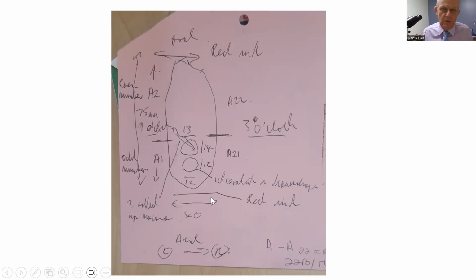Because Vikash also will have measured the size of his resection. Notice Vikash mentioned, for example, to pick up where 3 o'clock is, and I do the same. So I say that is 3 o'clock, and that, by inference, is 9 o'clock.